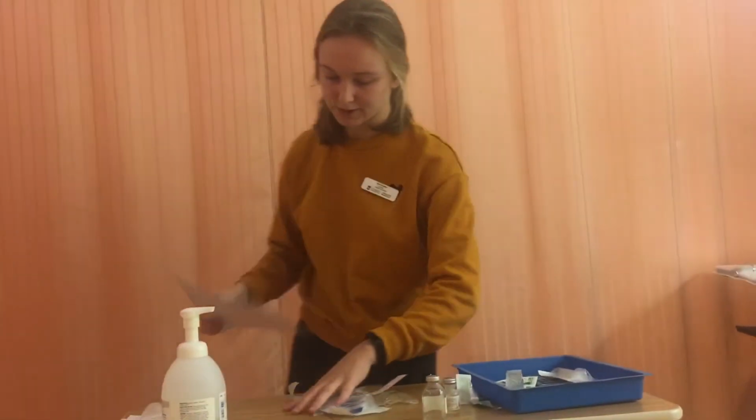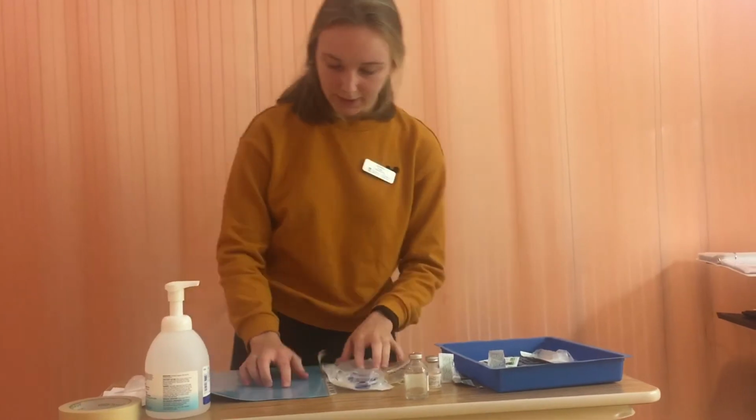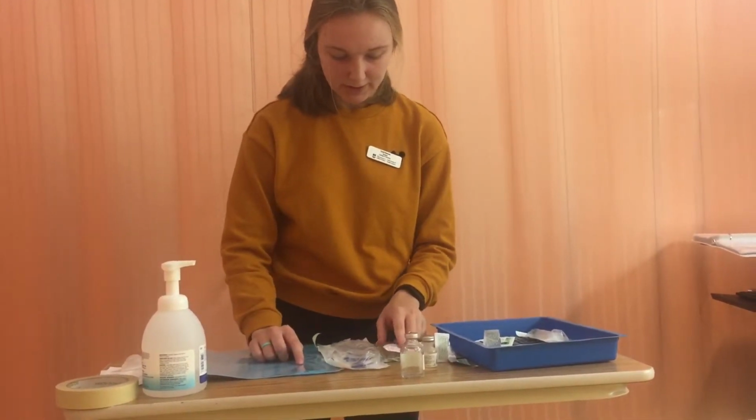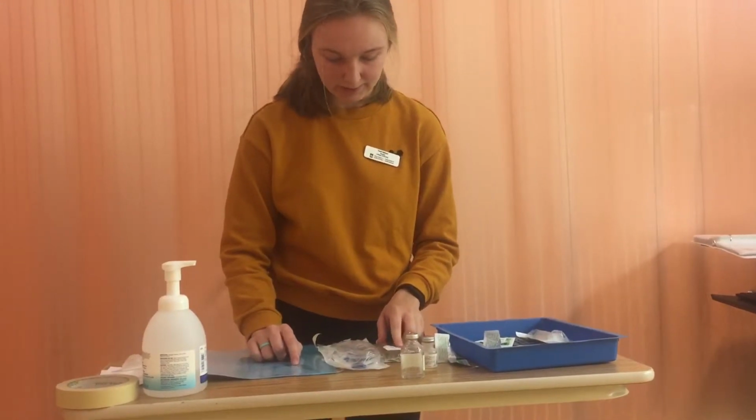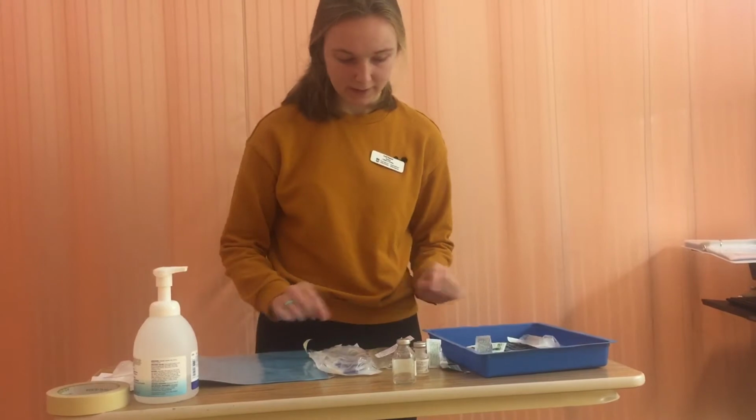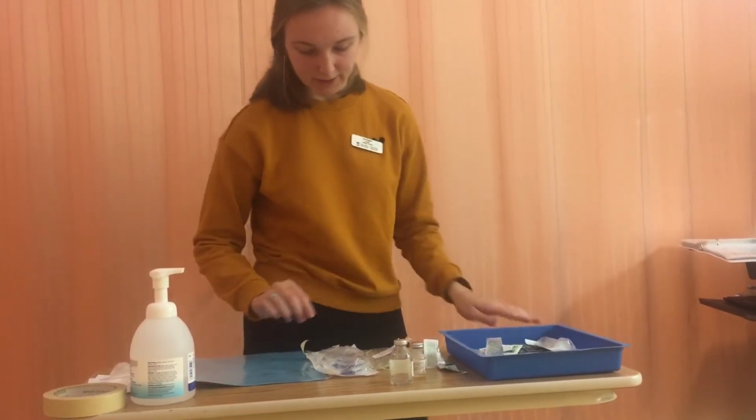Now I'm going to do my third check. So we have Emma Wrightson, Penicillin G, 3 million units, 3 million units. The route is IV, and we have it in a mini bag, and the right time to give it is now. So now I'm going to educate my patient.